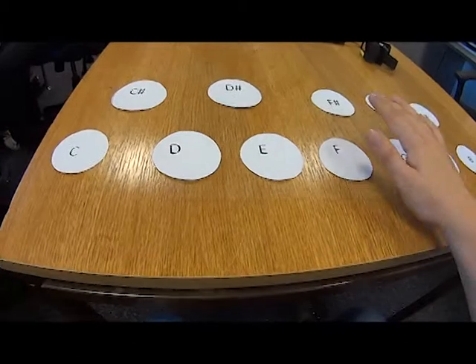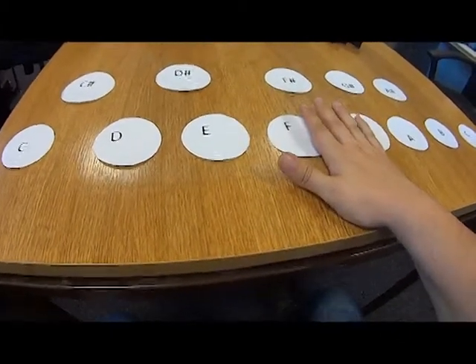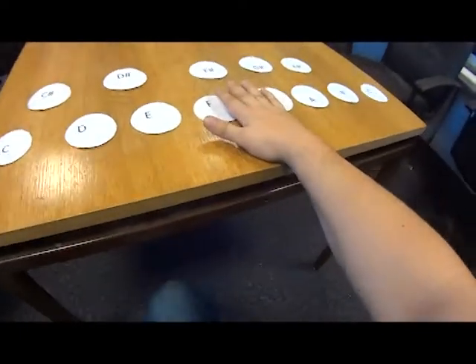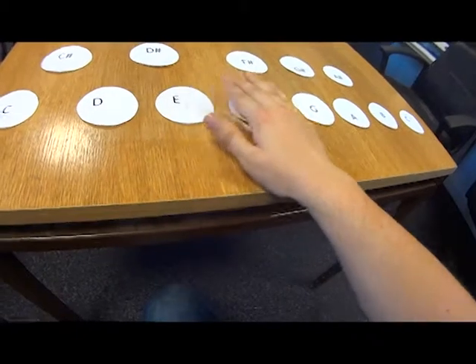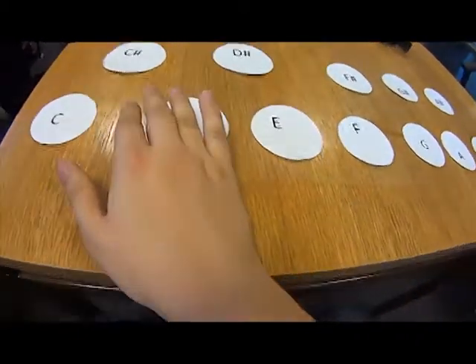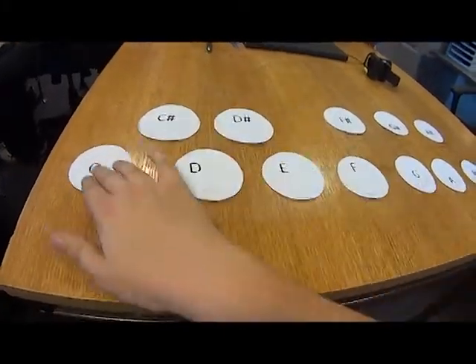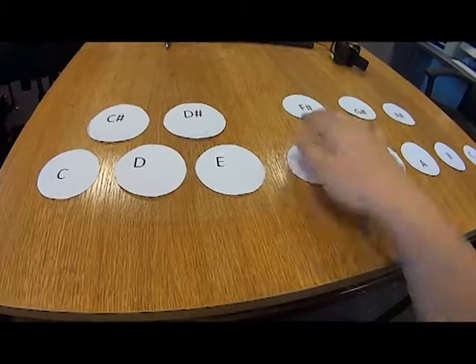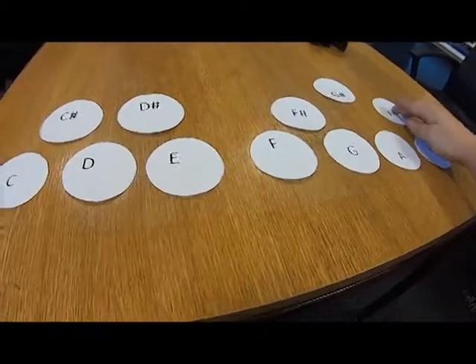Also, it's ideal if the person's natural resting place of the hand is between F and G, so that they get the actual wrist motion with it, as you see as my hand goes along. So this is what it would work like if everything was finished and it was real. I'm just going to show you.